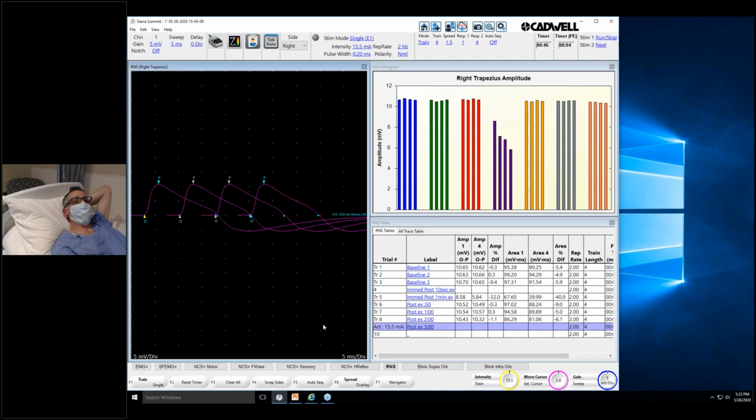And I think one of the other pitfalls just in general with the spinal accessory nerve is people don't slide around to find the nerve. So if I see a study and it required 100 milliamps to stimulate the spinal accessory nerve, either the patient's got a huge neck with a lot of muscle, or whoever performed that just didn't slide around to find the nerve.